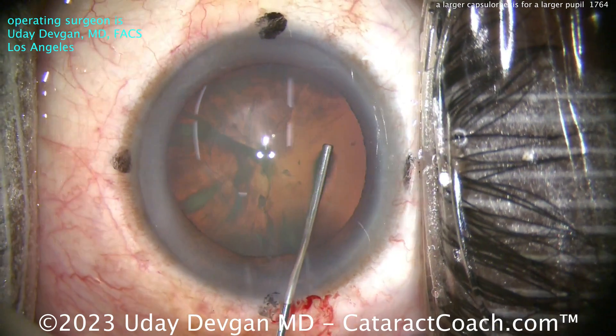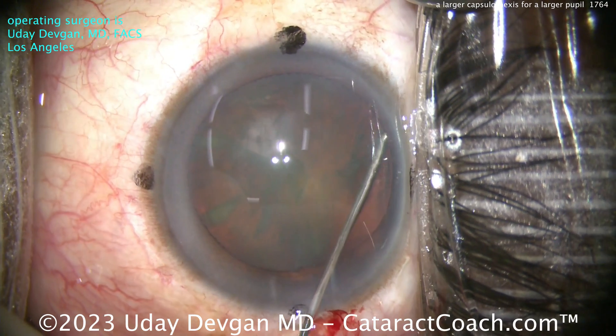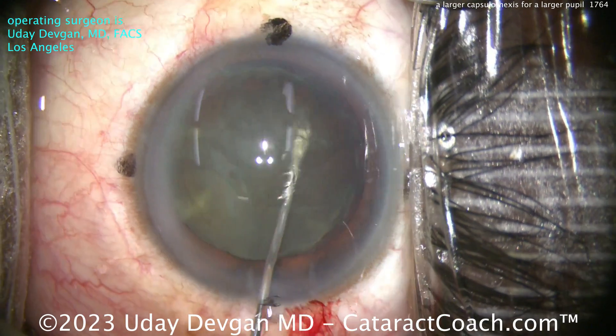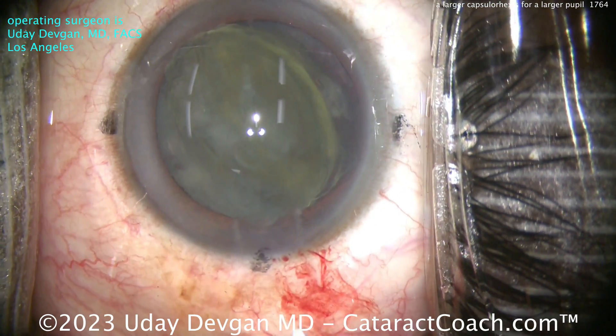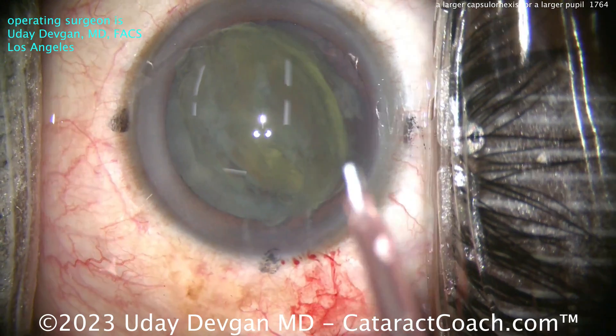We'll get the cataract out and then I'll show you the rest of the case. Remember, you can certainly tailor the size of the rhexis to your patient. The biggest IOL optics we have typically are about six millimeters in diameter. There are some six and a half and even seven millimeter lenses, but most seven millimeter lenses I know about are PMMA, which require a very large incision and are non-foldable.